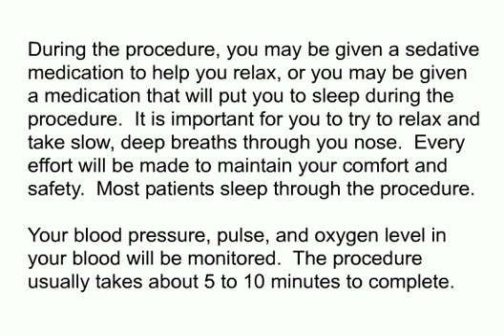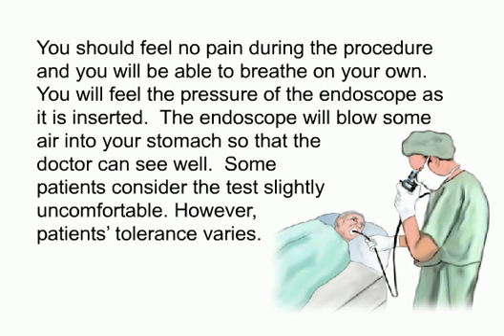The procedure usually takes about 5 to 10 minutes to complete. You should feel no pain during the procedure, and you will be able to breathe on your own. You will feel the pressure of the endoscope as it is inserted. The endoscope will blow some air into your stomach so that the doctor can see well. Some patients consider the test slightly uncomfortable. However, patients' tolerance varies.